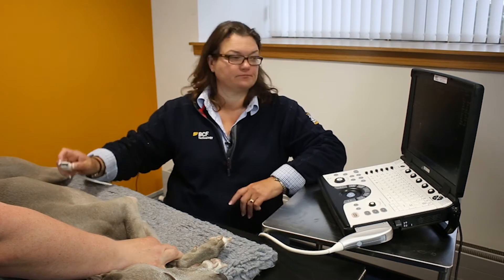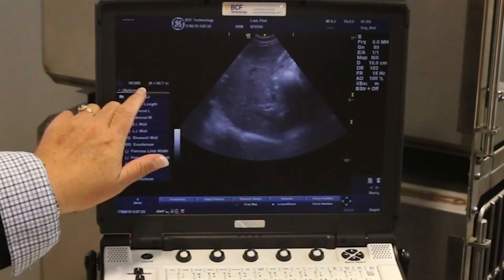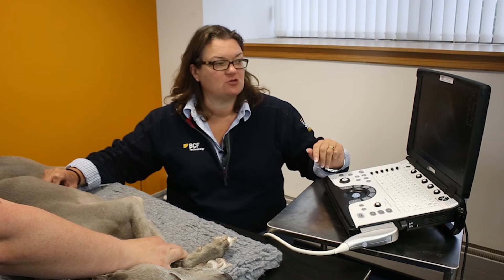Now let's go through how to save and store a still image and a clip. You'll notice that you've got a counter here. This is a constant memory buffer that's running all the time. This is a very useful thing.